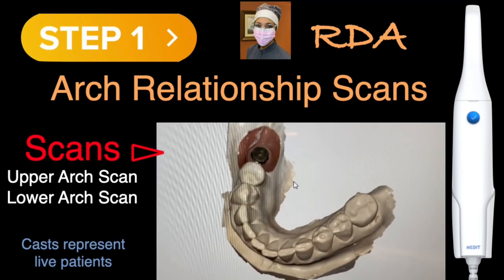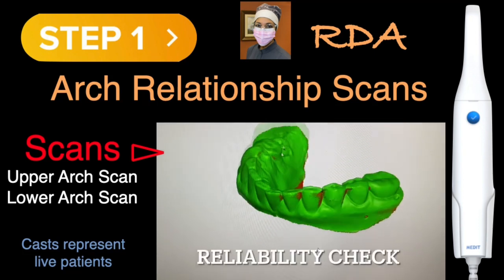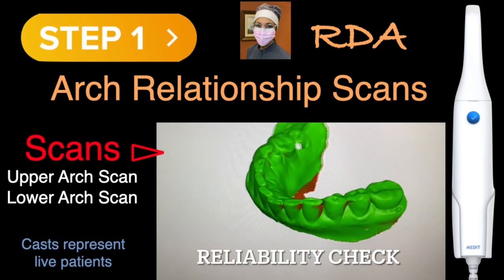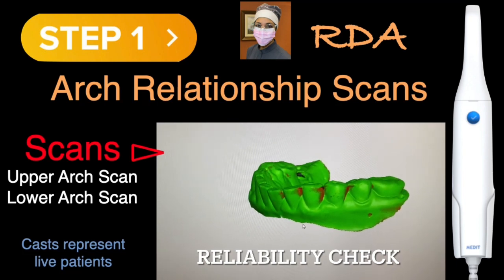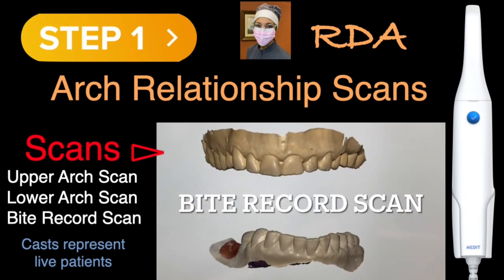Now, one of the cool things before you advance between each of the scans is to look at the reliability test, and you can even scan with this on all the time. This tells you that the STL file has the proper capture, because the green is good, the pink needs to be scanned a little bit more, so the dental assistant will go back in and make sure that this is really accurate before we get to the next stage.